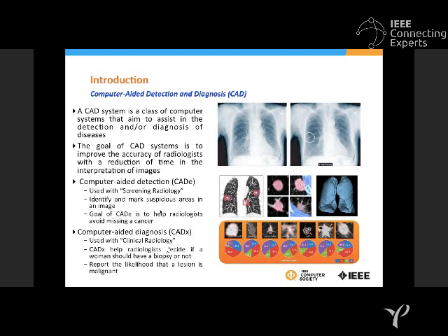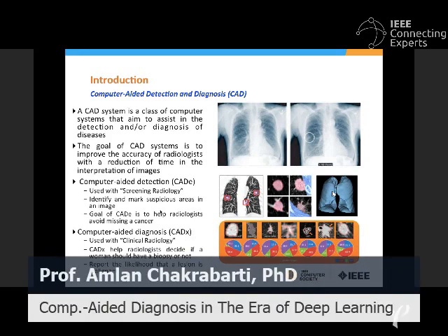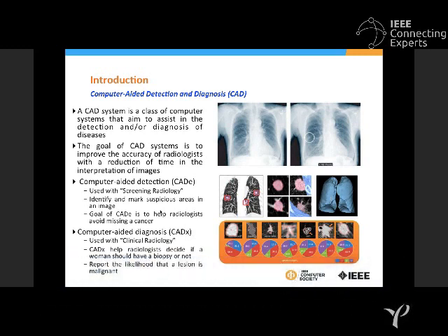So similarly, if we go to computer-aided diagnosis, the figure what I show next tells a story. It tells that once we detect a particular deformity in an image, or a sort of suspicious patch or suspicious region in my image, this CADx, which is called computer-aided diagnosis, will actually do a sort of risk analysis of this particular region.